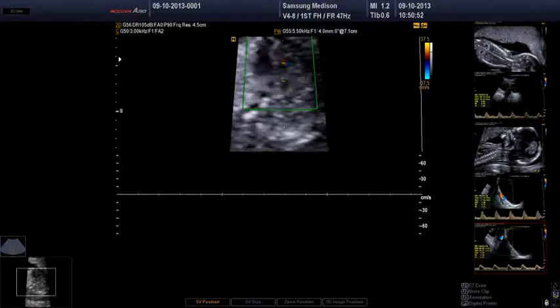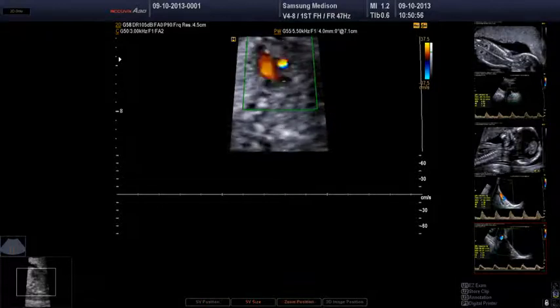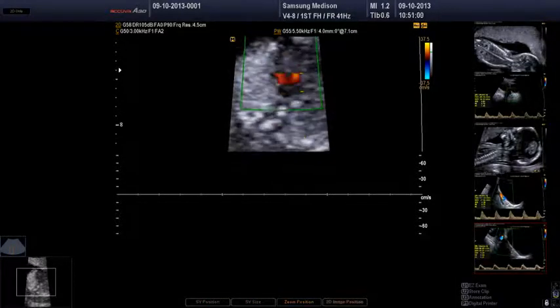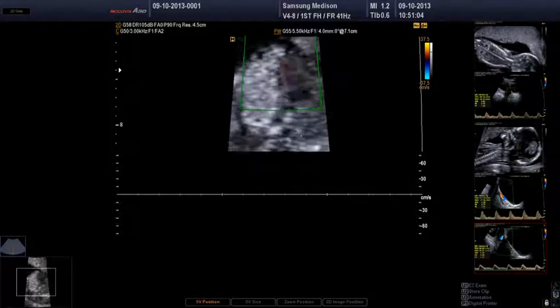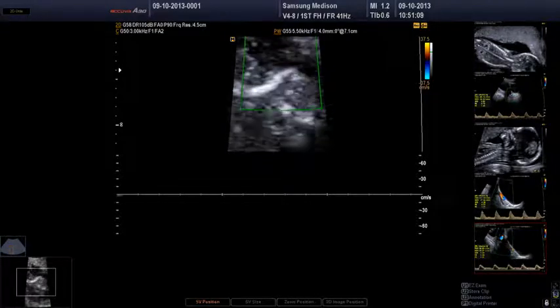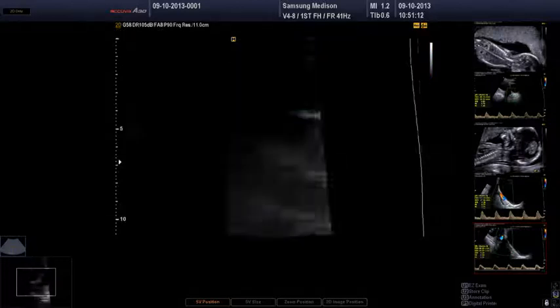The other thing that colour's useful for is often if you have regurgitation, it will be discrete. Actually, let's just put the gate just across the aorta as well as the valve. So colours, yeah, try there. Yeah, go on.